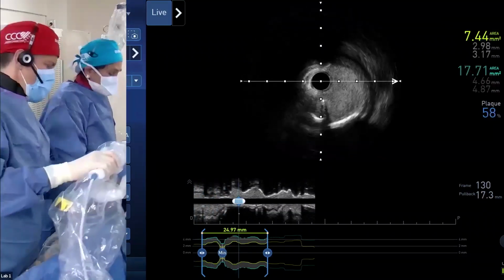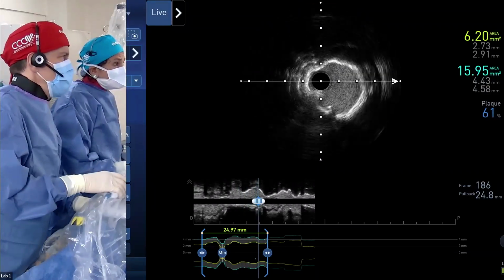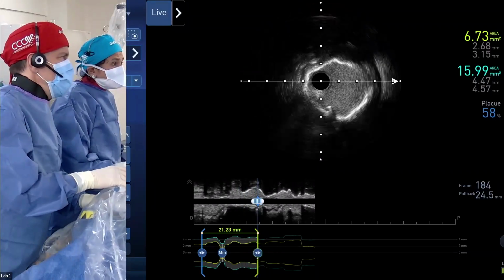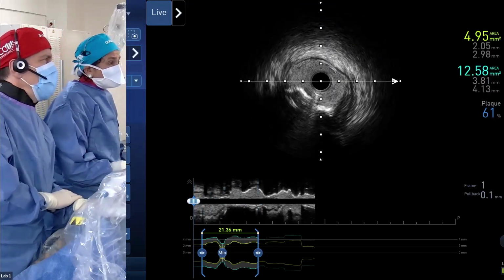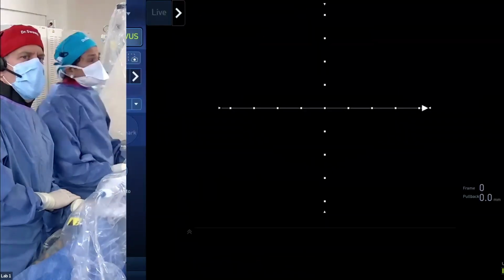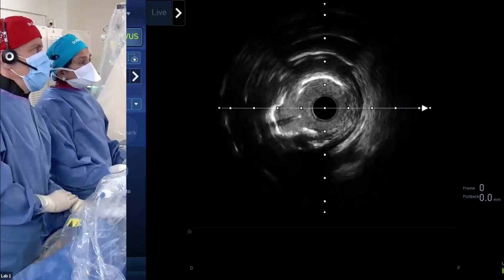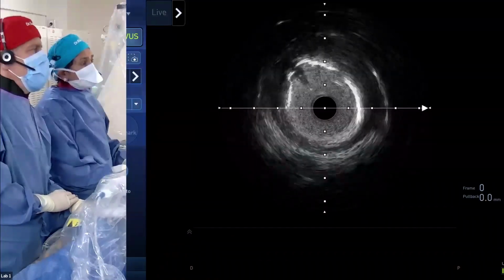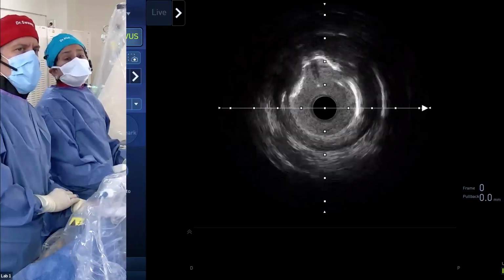But this is most likely going to be a 2 stent procedure, so you really want to have good expansion. And so you have to push on vessel preparation. Again, IVUS is not going in here. Can you see anything? It's not a tight part, but can we stop? That's the LAD. No, I'm trying to get into the diag. The diagonal's really tight. I don't think that it's the diag before the diag.